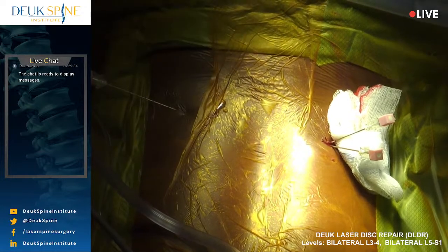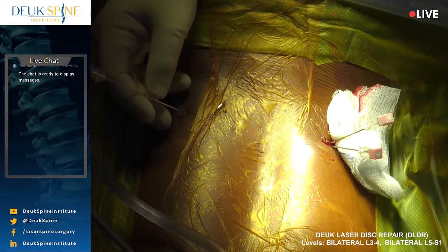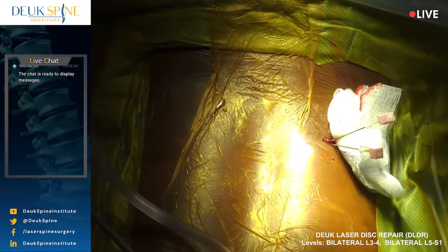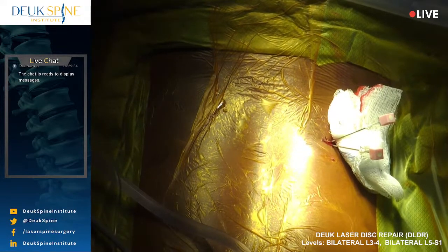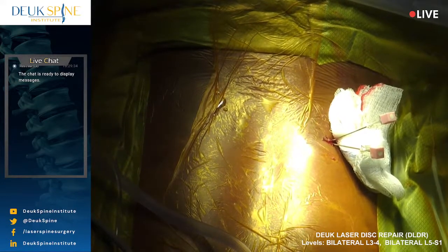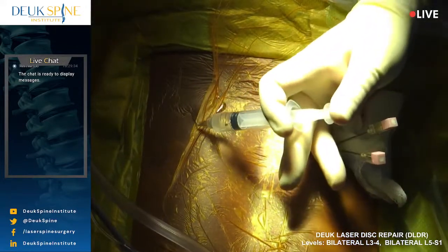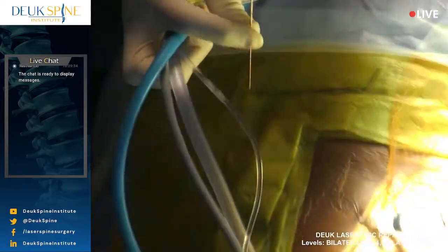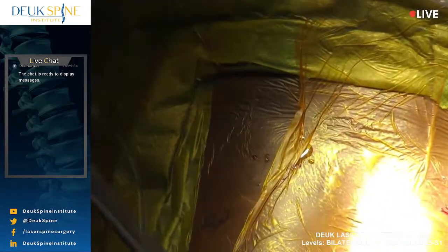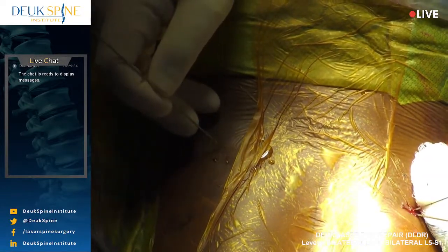All right, so I'm a little higher than I want to be in terms of my trajectory. I think I'm going to start a little lower. Give me some more numbing. You're doing really well, by the way. We're halfway done. And I just have to place the other 2 needles on the right side. I'm trying to give you some more numbing medicine to make it more comfortable for you. I don't want you suffering needlessly through the procedure.